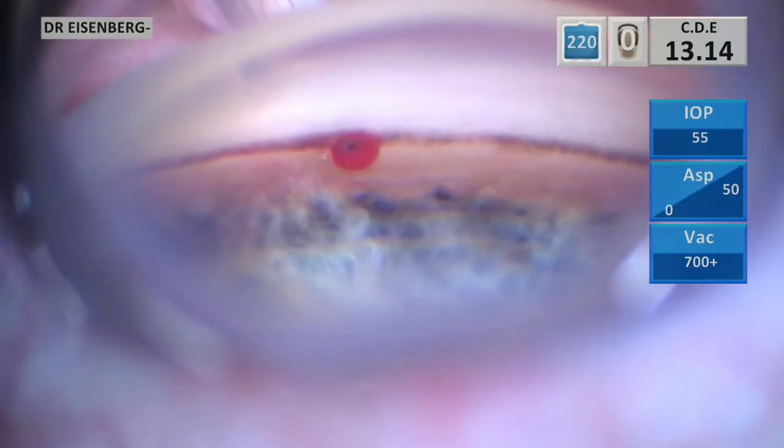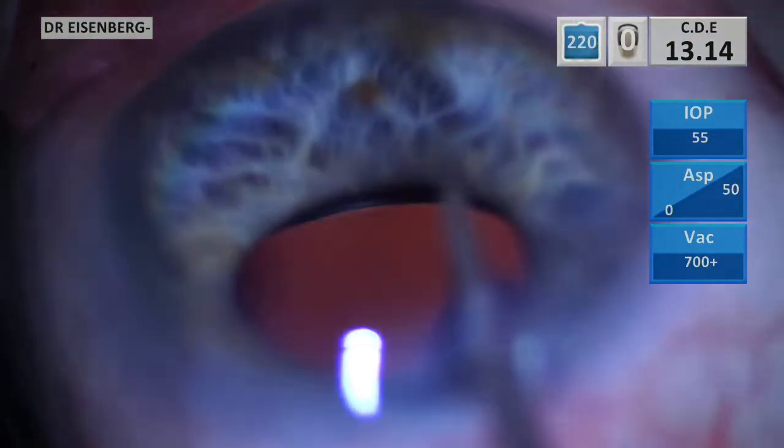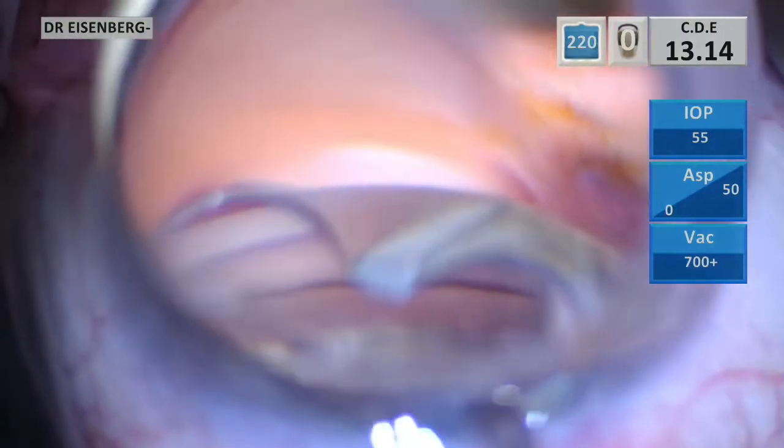There's nice proof of concept — we hit that perfectly. I really believe this is the better location for the stent. Between stents, I move the scope. Everything has to change: my seat, my scope. I angle it differently — I want to get another perfect on-axis view.